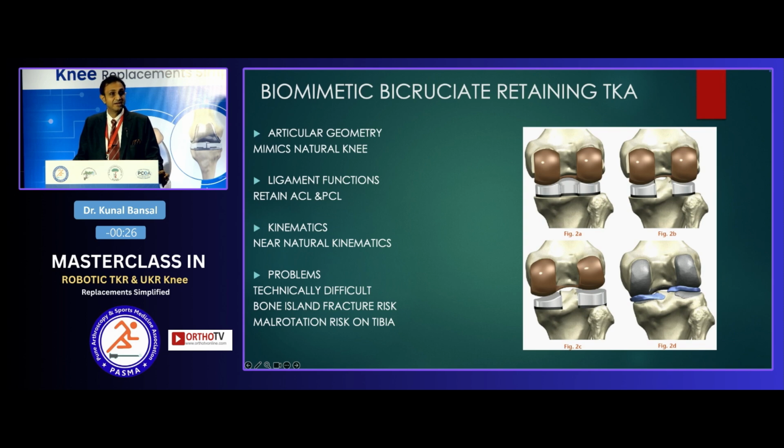The biomimetic bicruciate retaining TKA retains ACL and PCL. At the same time, it mimics the natural kinematics of the femoral and tibial components. Technically difficult, with bone island fracture risk as in the previous implant, and malrotation risk. But again, these implants need further research and further publications to see the efficacy of these implants. But theoretically, this comes closest to mimicking the natural knee.